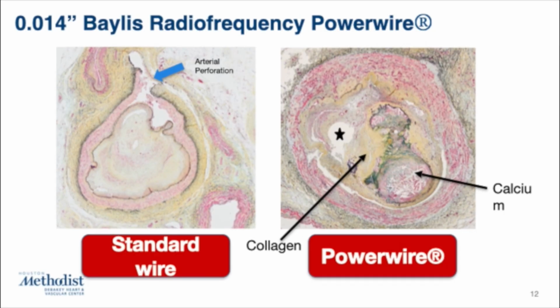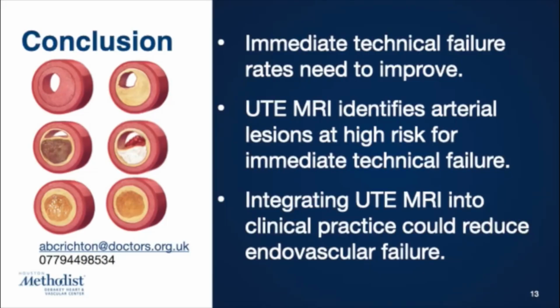And we've worked with Baylis Medical Technologies on their radiofrequency power wire. This lesion is hard, it is mixed collagen and calcium, and you can see that we have now been able to pass through. That star is showing you the catheter imprint. This was previously non-crossable.